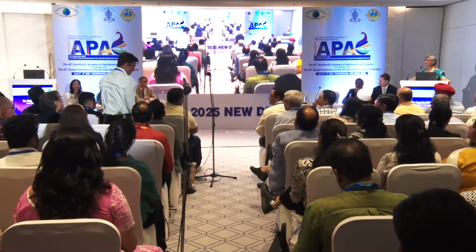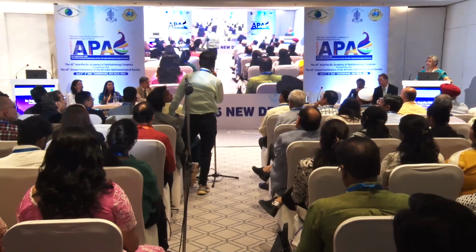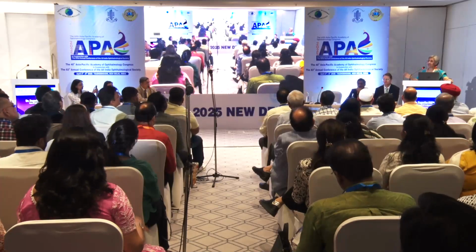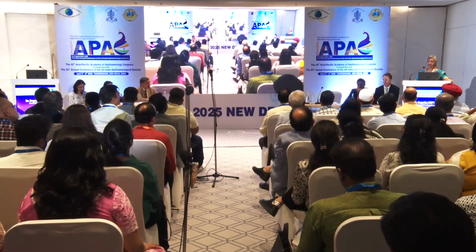Do we have any questions from anyone in the audience? What about AS-OCT in glaucoma? Yeah, we have AS-OCT, but sir, I would definitely place my bet on gonioscopy, and a proper good gonioscopy done in the correct methods, having a semi-dark room, etc., before I place my bet on an AS-OCT. I think for a general ophthalmologist who has an OCT with anterior segment OCT, to rule out angle closure, it may be a great idea, especially if you don't have a glaucoma specialist around you. So yes, I think that makes a difference also.